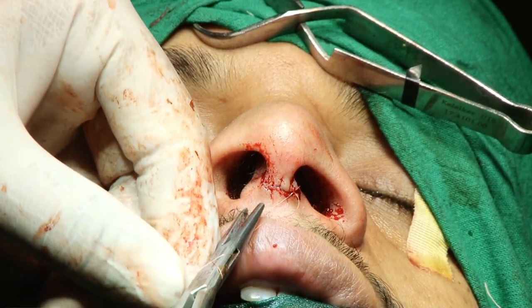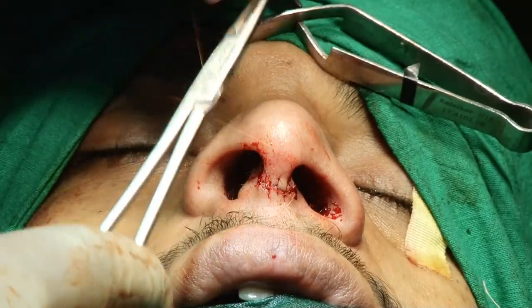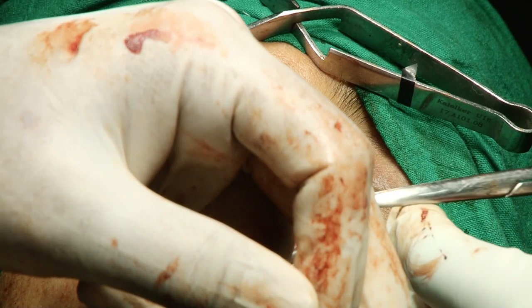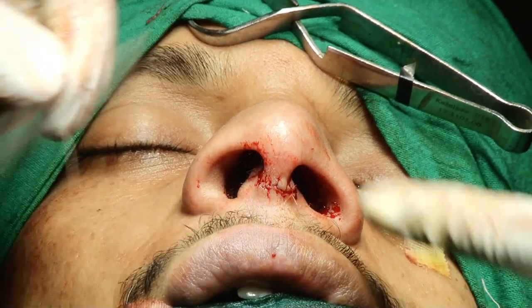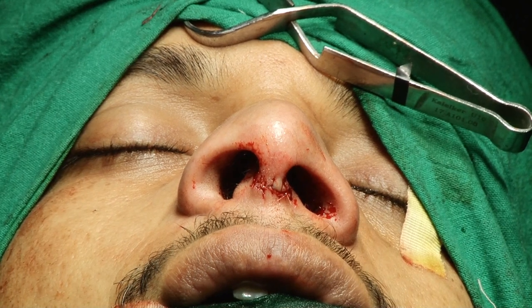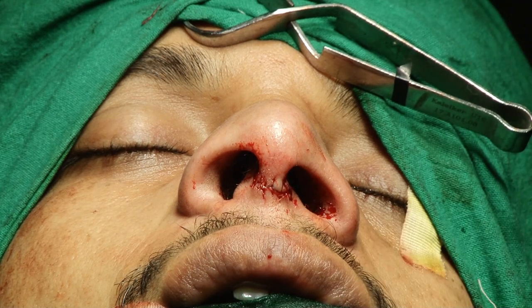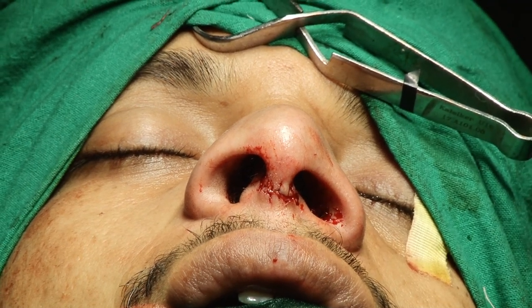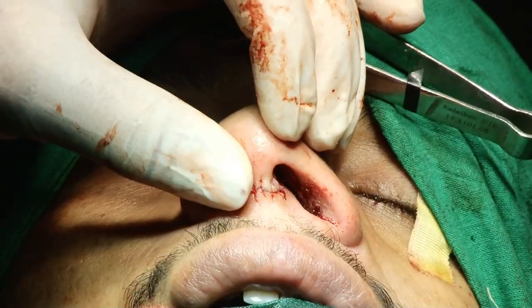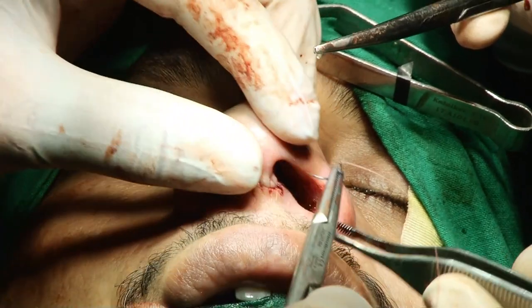I'm not fine with any patient's scar. And after 10 days when we remove the splint, it's very good. But in your patients, how many days do you keep the splint? Yeah, for about 10 days as well.